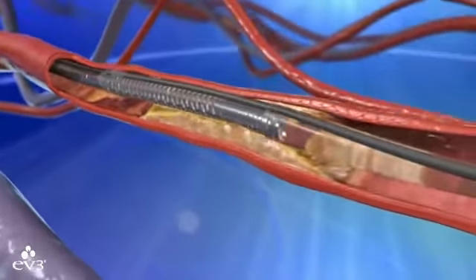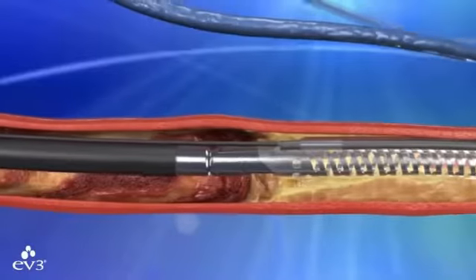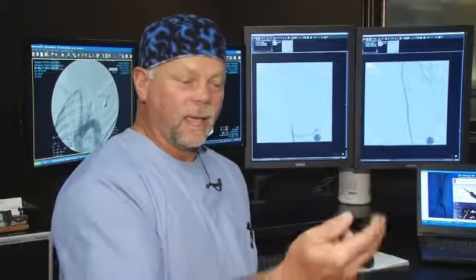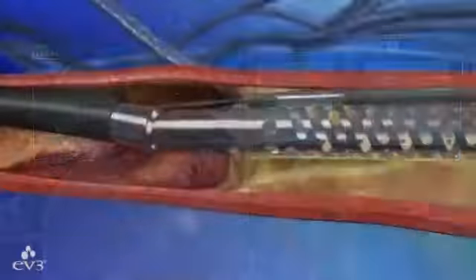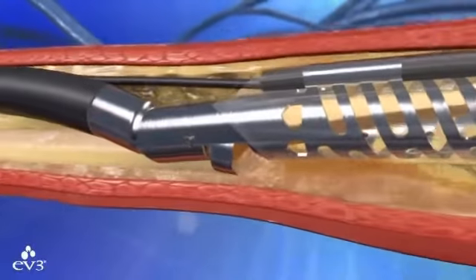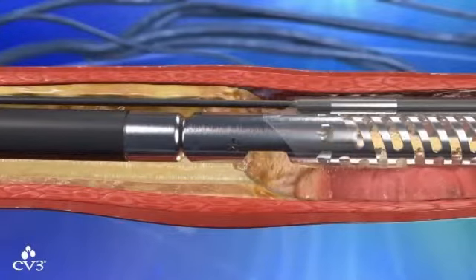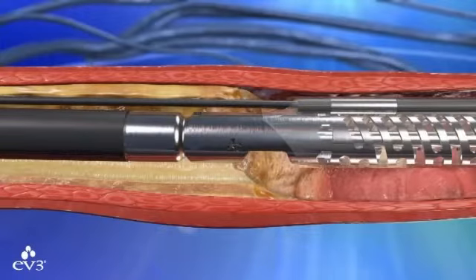The TurboHawk is a device inserted into the blocked artery. Inside are four tiny blades that cut the plaque, and with the shape of the disc it cuts with, it pushes the plaque forward down into the catheter. The one-hour procedure doesn't just push plaque to the sides where it can regrow — it grabs and removes it. They pull it back out after filling it up, empty it out, and go back down to cut more out.